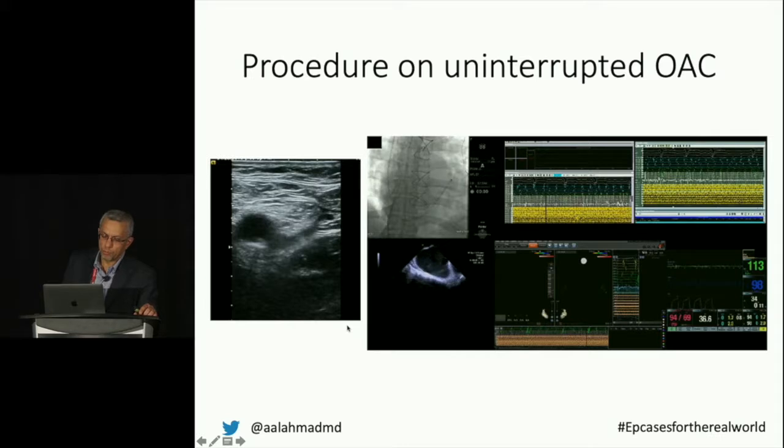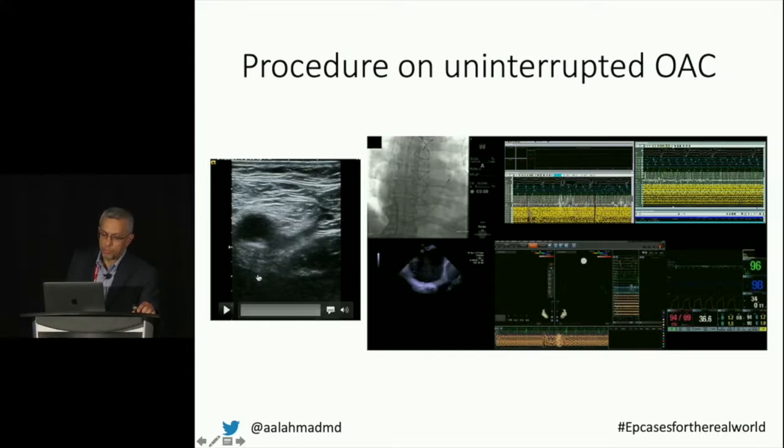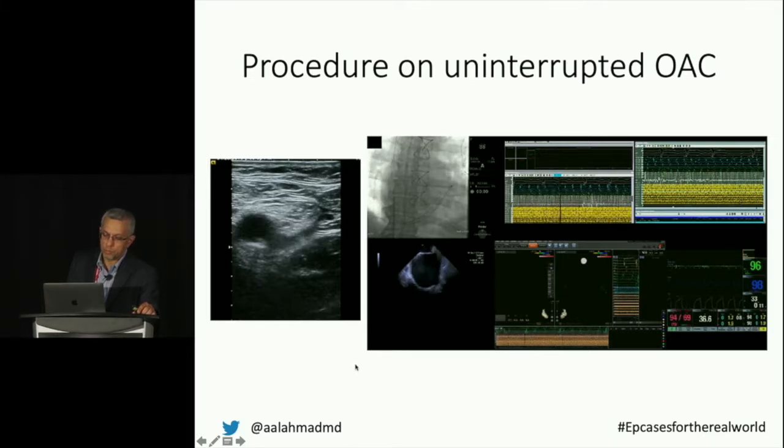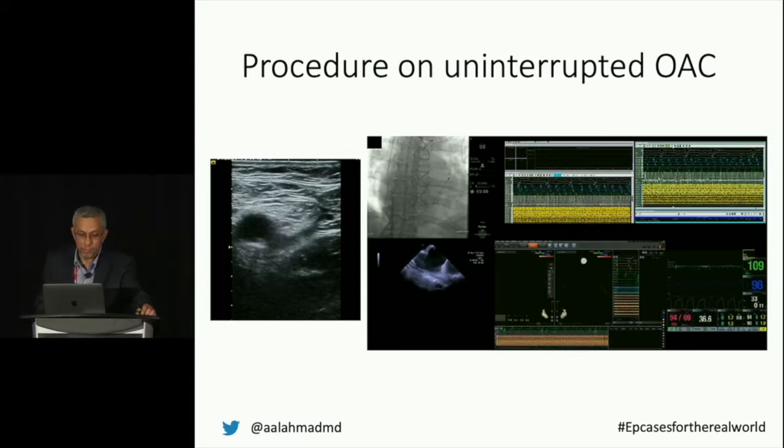And I think just a reminder for everybody that fluoro can actually be deceiving when you're trying to do a transseptal and trying to understand where things are. And some people, in particular with very large atria, look how the needle is pointing almost towards the right atrium. And yet, despite that, that's actually a perfect position where you're tented very well. And that's a great position to cross. So again, showing the power of intracardiac echo and the utility of that to maintain safety, because otherwise you wouldn't necessarily know that in this type of a patient.